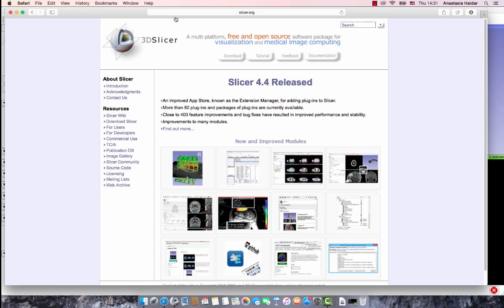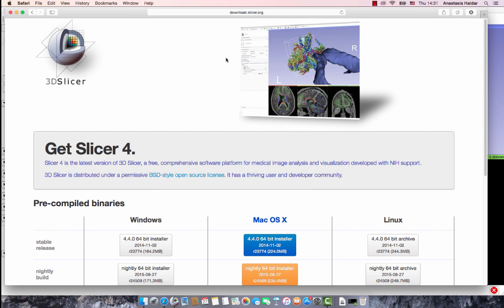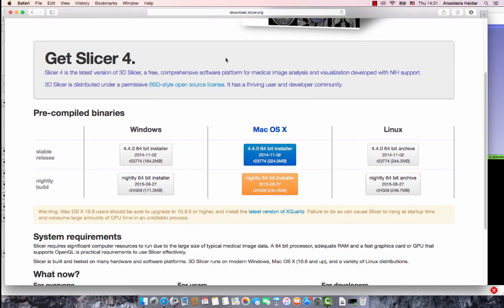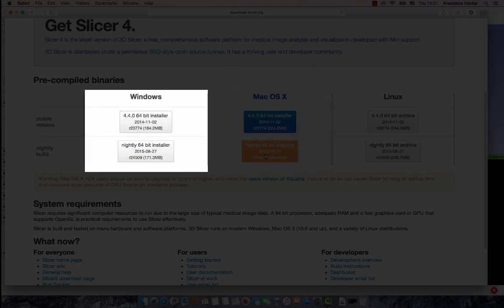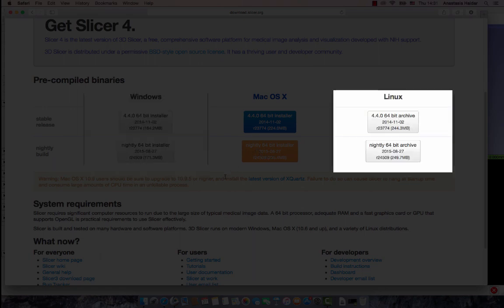For those of you who don't have Slicer, go to slicer.org and click on download. There you will find a choice of stable release or nightly build. I am using the Mac OS X nightly build, but you are also able to download it for your Windows or Linux computer.